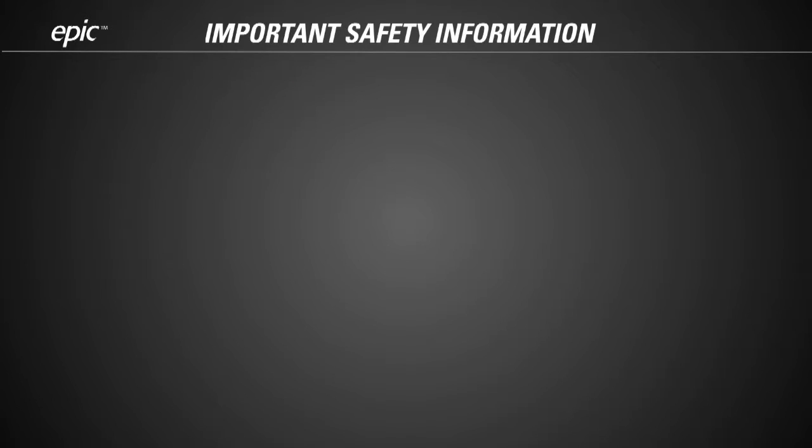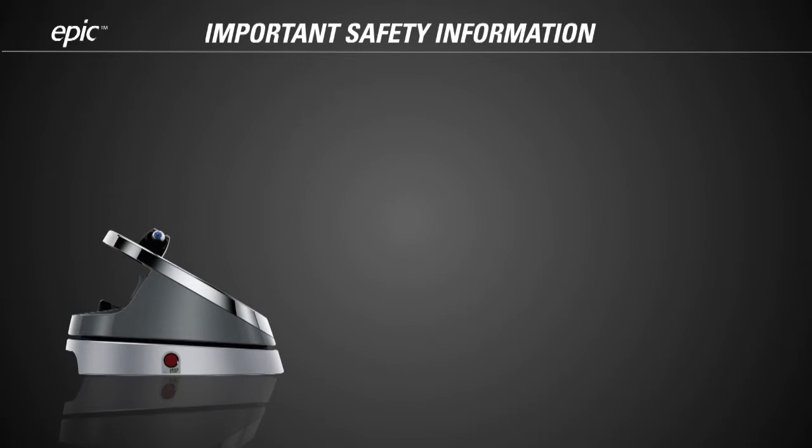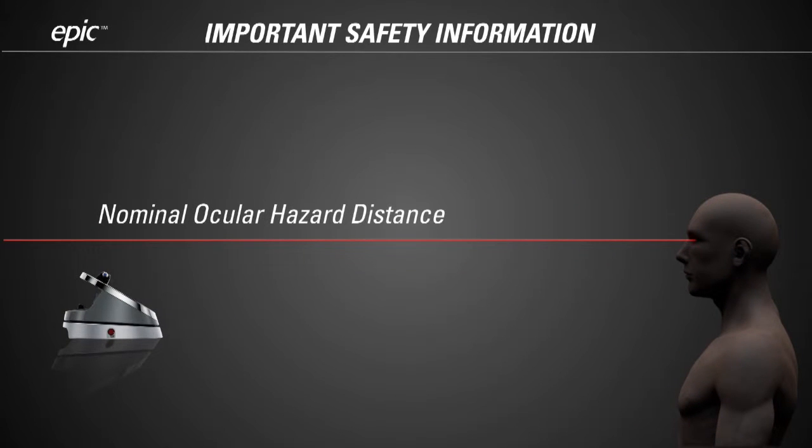Before you start using EPIC, there is important safety information that you need to know. The EPIC produces laser radiation that can be hazardous to the human eye. The nominal ocular hazard distance, or NOHD, measures the level of laser hazard. It is a calculation of the closest direct distance from which the laser light might be safely viewed by an unprotected eye. The NOHD for EPIC is 2.6 meters, or about 8.5 feet.